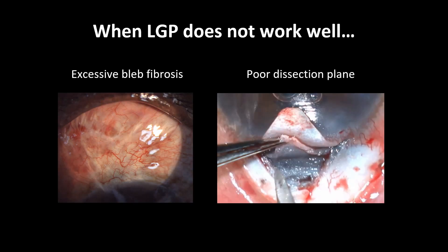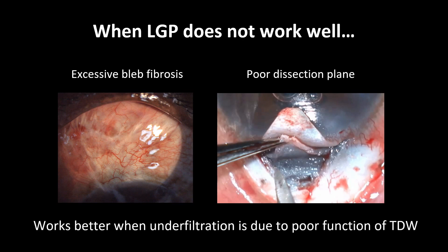Note: for LGP to work, the deep flap dissection should be proper. LGP should be considered as part of the NPDS, and not as a failure or re-intervention.